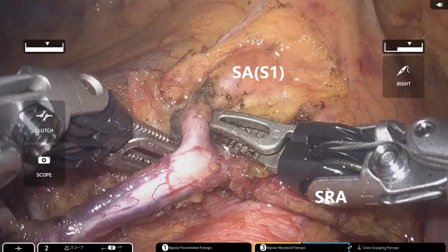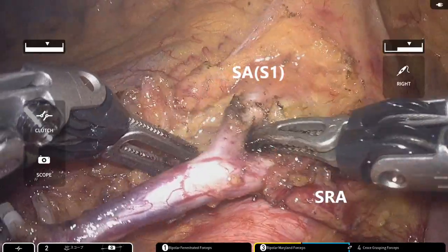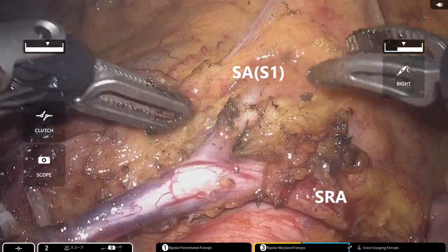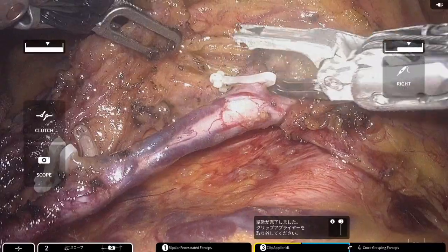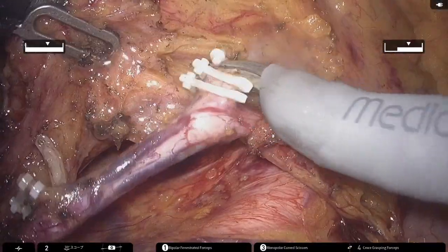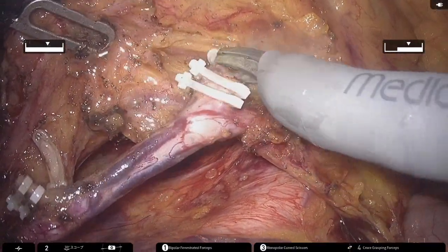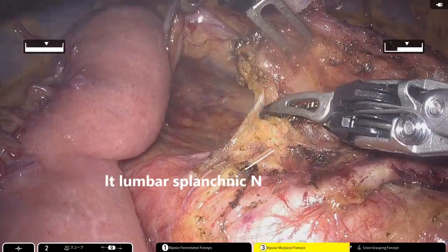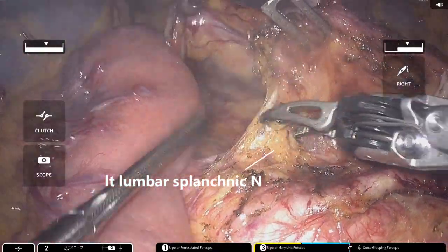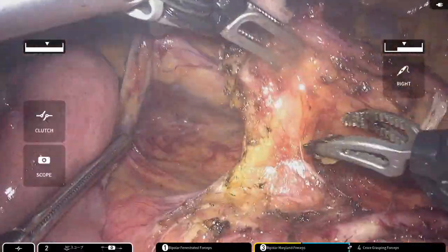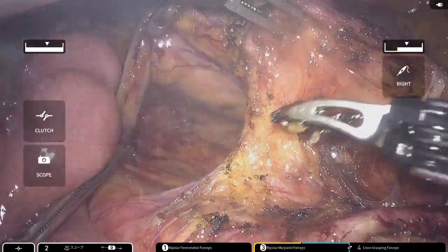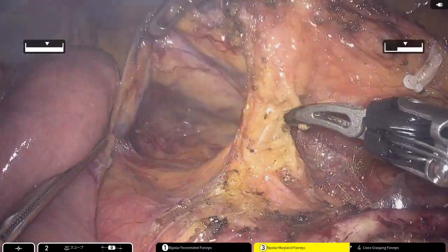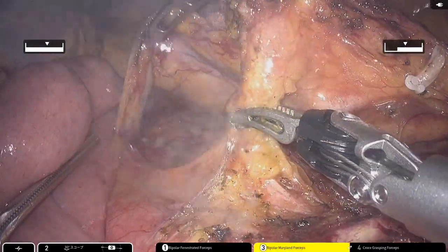In this case, the blood supply was primarily via the left colic artery, but dissection was extended distally to divide the first sigmoid artery. Careful dissection is performed while paying attention to avoid injury to the left lumbar splanchnic nerve, connecting it with the previously created dissection plane.